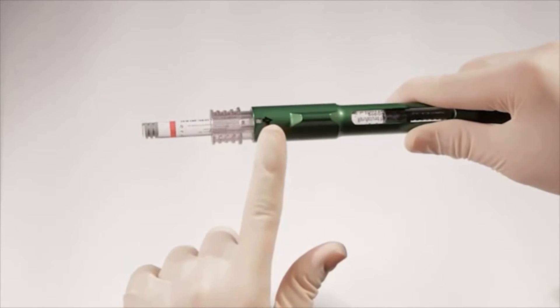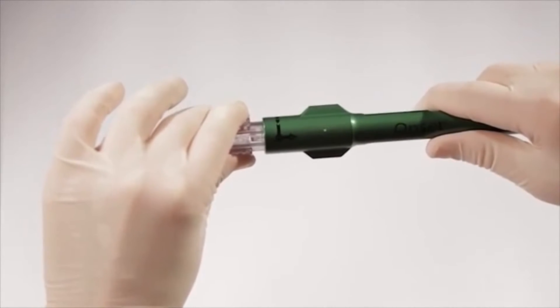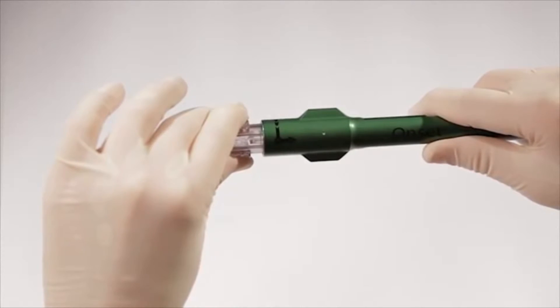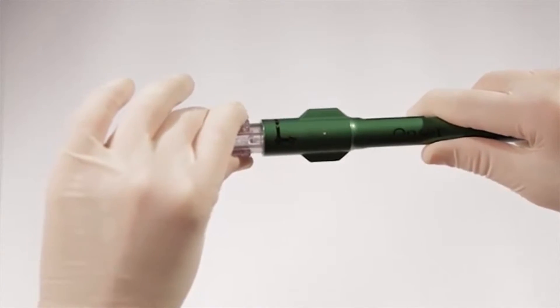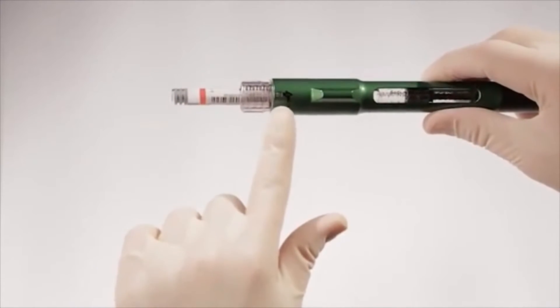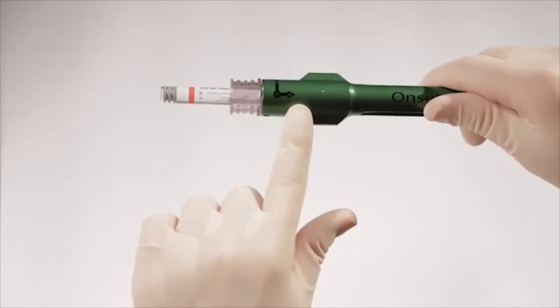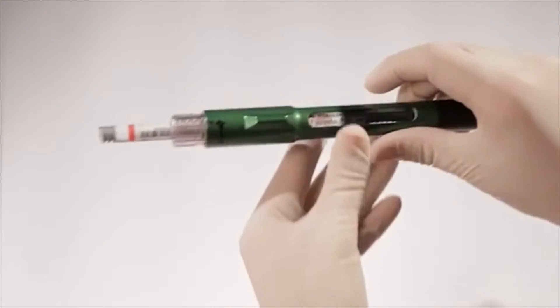Then turn the connector clockwise one quarter turn to lock the 1.8-milliliter cartridge in the connector at position number two. Then push in the cartridge connector to position number three. The path to go from positions one, two, and three and then back is shown on the pen.